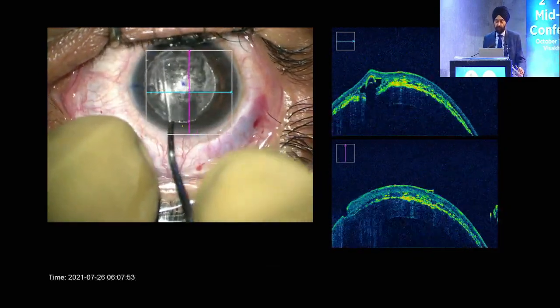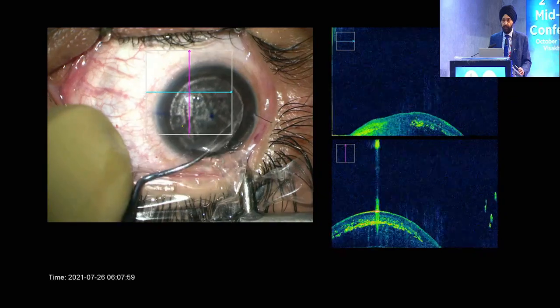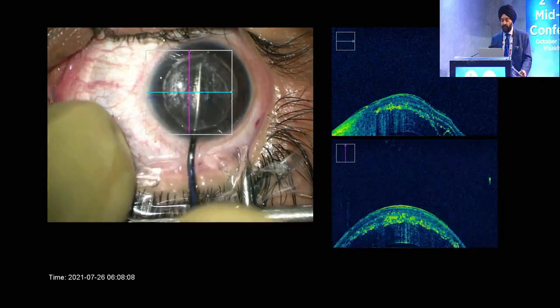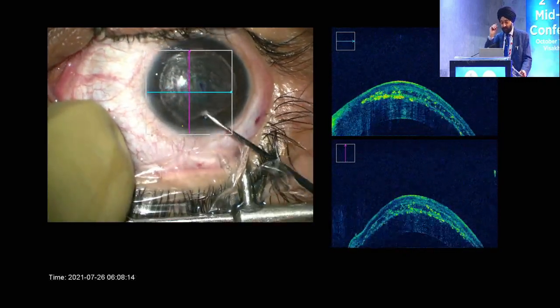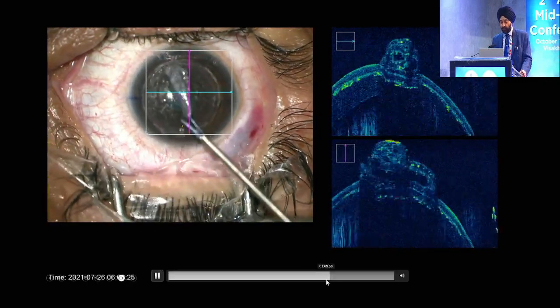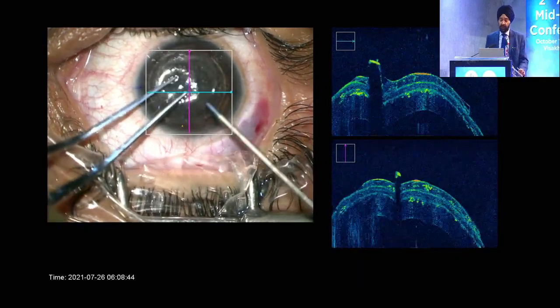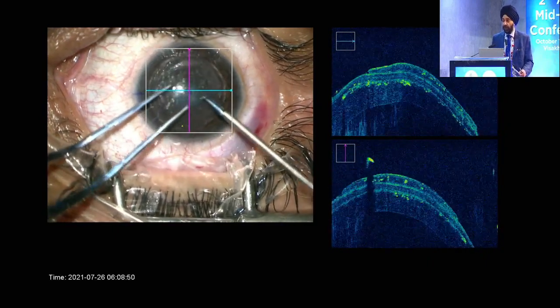And what is the reason for this? The spot size is only 1 micron, and there is no spot separation, and there is no line separation. That means that they are adjacent to each other. I personally feel that maybe we can do a 1 micron spot separation, which can help. And you can see even the posterior one on the OCT. And this is very easy to dissect out. And this is the lenticule which comes out, and on measuring, if I wanted a 6.2 lenticule, I will get a 6.2 lenticule, and you can spread it. During the study, there has been 0 incidence of any retained lenticule. There has been 0 incidence of any suction loss.